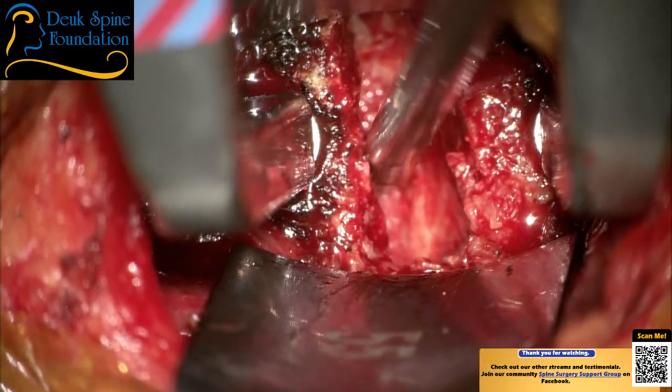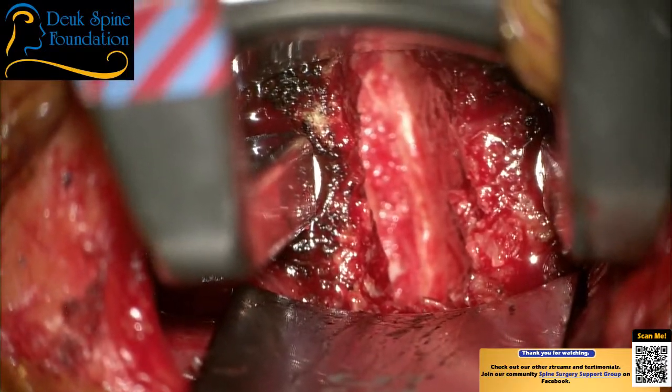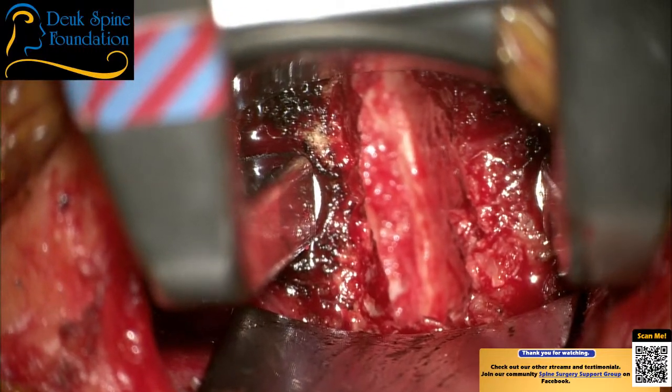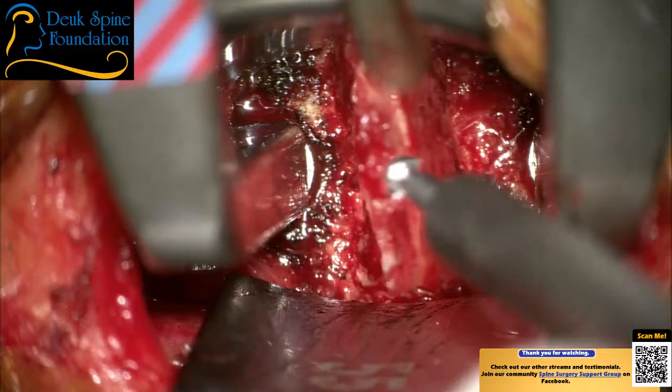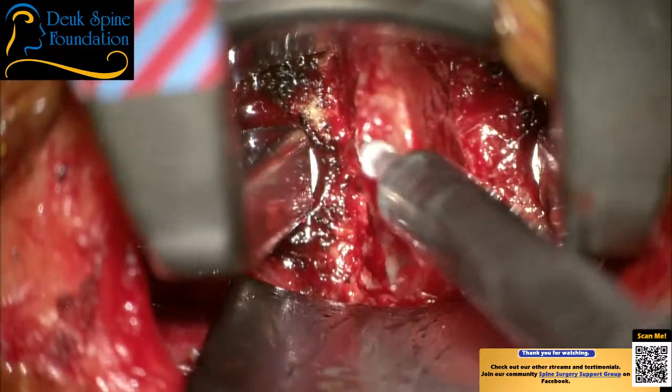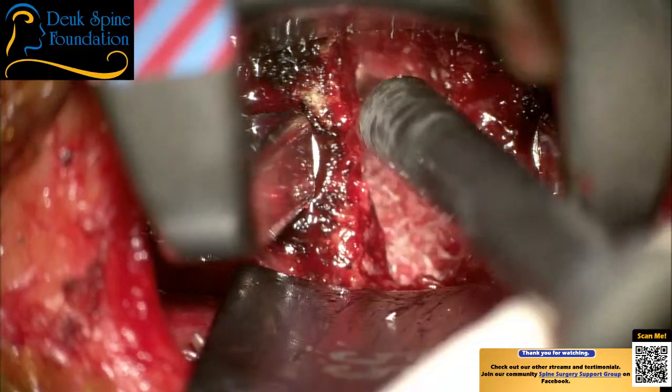Drill. At this point, we've got bone spurs in the back of the disc that need to be removed. They're not big bone spurs, but there are bone spurs. So this will help open things up by removing them with a drill.